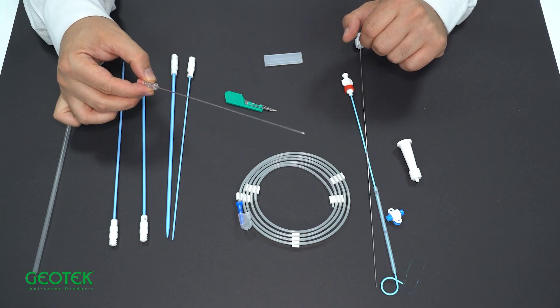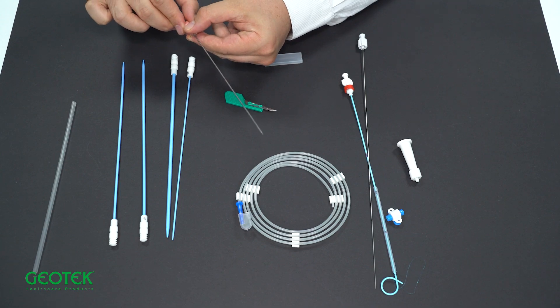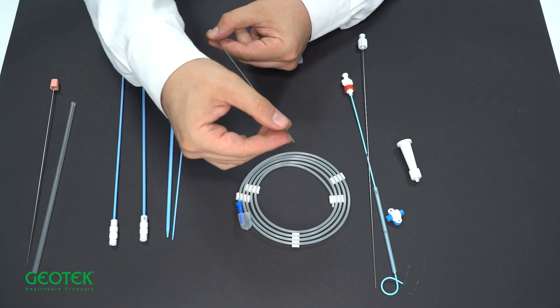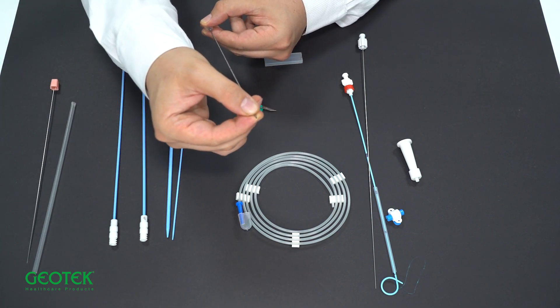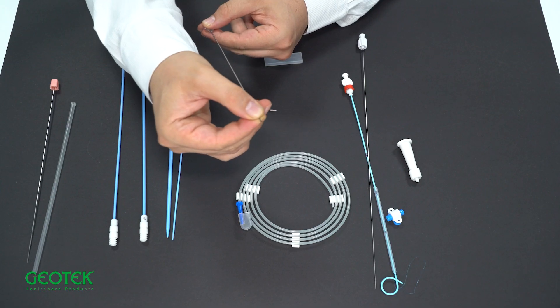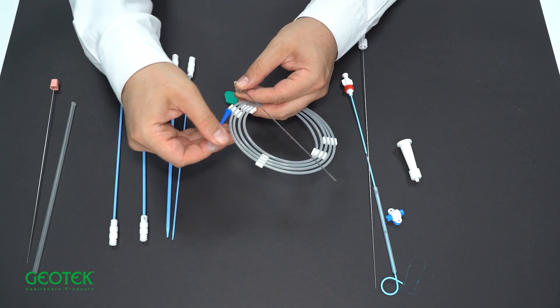First of all, the Shiba needle is inserted. Then the pointed obturator is withdrawn and a special blunt-tipped needle is left in the collecting system so that it does not cut the guide wire.